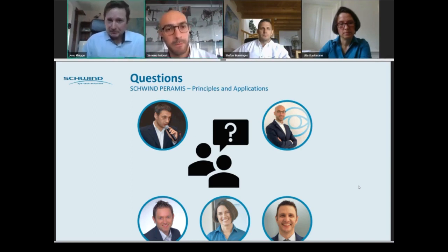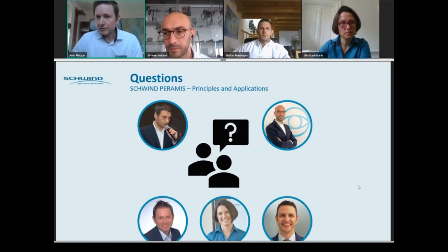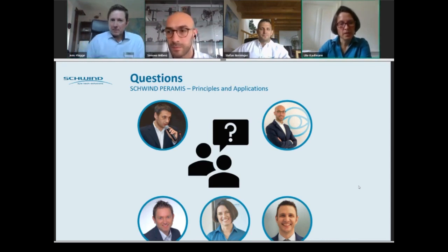All right. Okay. Then, if there is no other question from the audience, Ute, your microphone. There is one more question. How to acquire the higher order information to decide the treatment guide with Peramis?